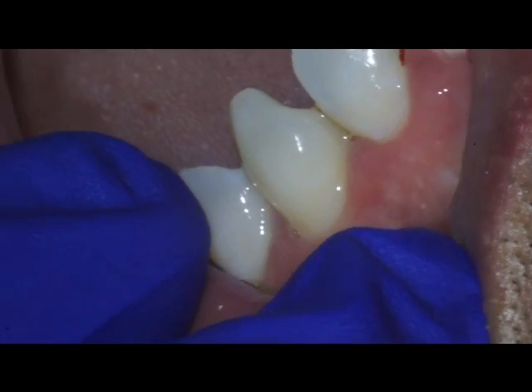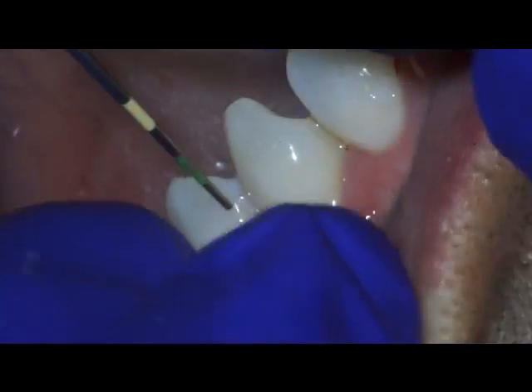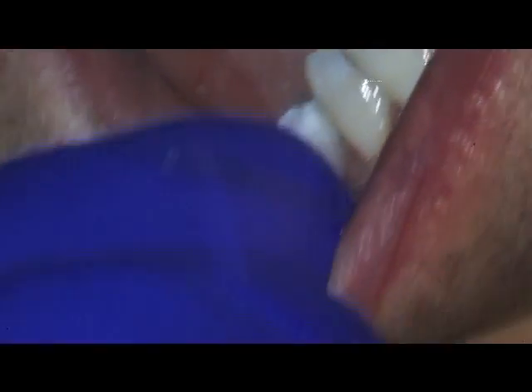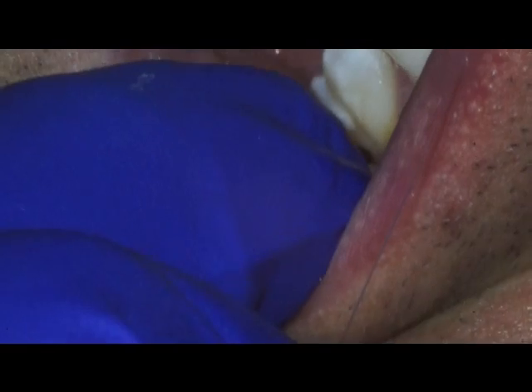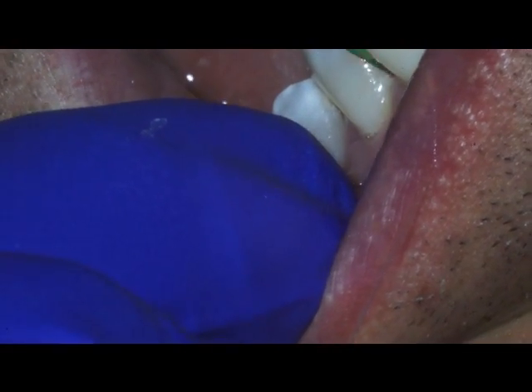Okay, so let's go ahead and start with your x-rays. I'm going to let this just rest here on your shoulder. I'm going to go a little bit towards the back here on the right side, okay? Okay, right down. I'm sorry if it's uncomfortable.